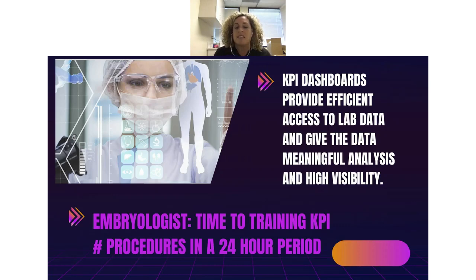KPI dashboards are very important to these efforts. They bring this data to light and help it have high visibility in our labs and also help to give it meaningful data analysis.